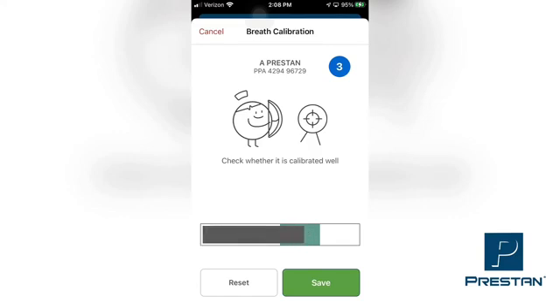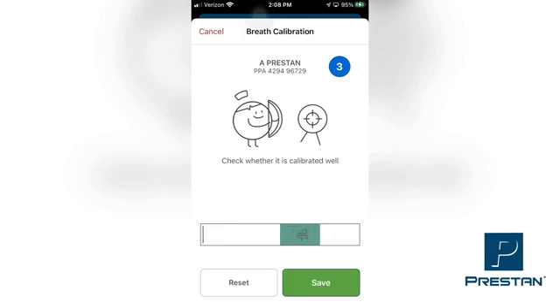To verify, perform at least 2 ventilations, making sure that the black moving bar on the screen is reaching the green shaded area. Once satisfied that the ventilations are working properly and you have sufficient visual chest rise, tap the save button to complete the calibration.